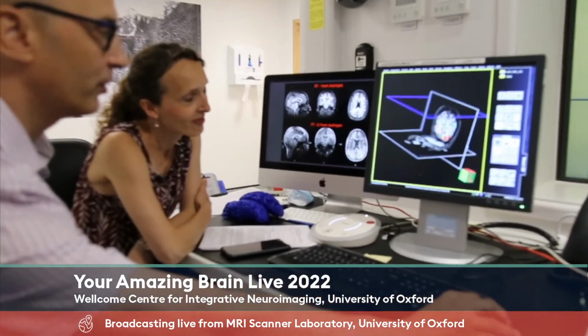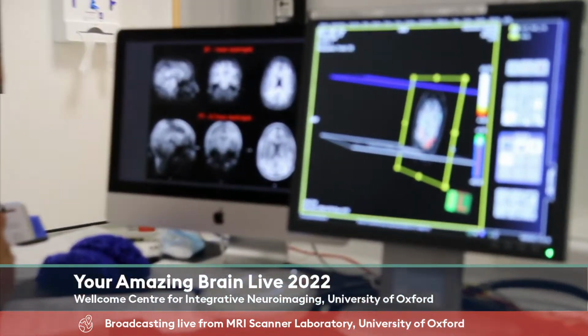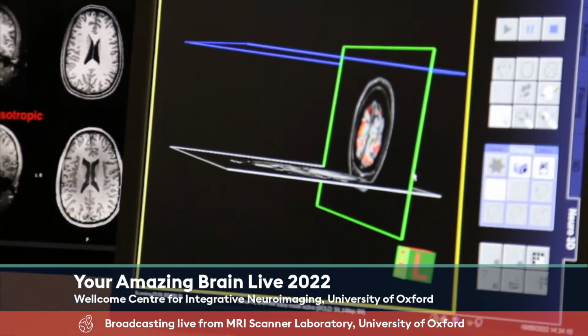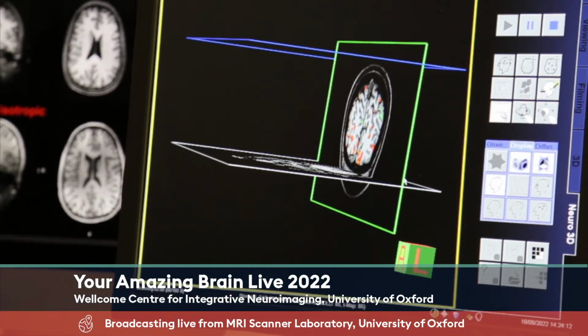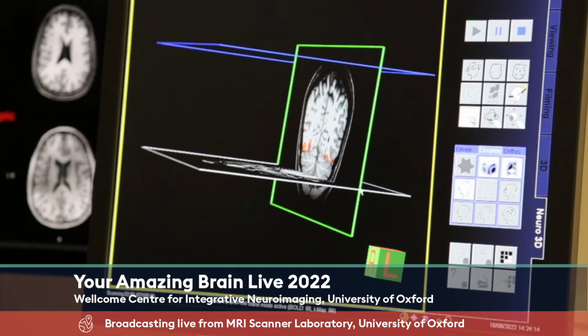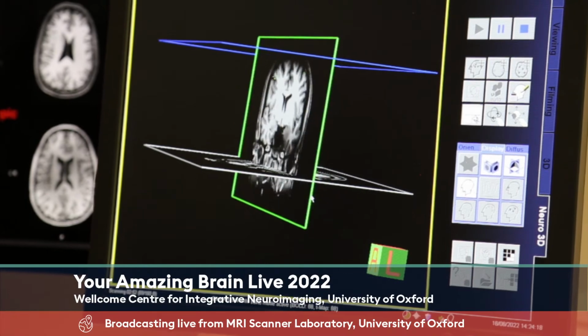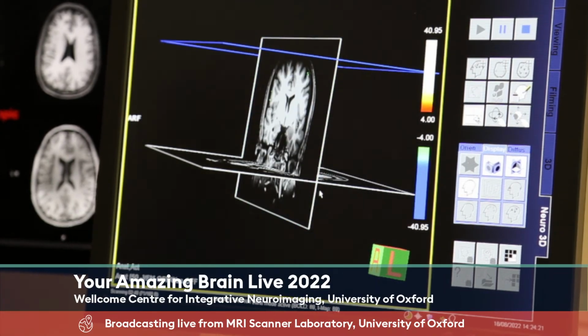So maybe if I can try and move back a bit. Move that back a bit. So we're getting the visual again, which is not surprising because she's looking at pictures again still, so we would expect to see that. But what about those other areas? What about that ventral striatum area you talked about? Are you seeing anything there? Let you scroll and find?